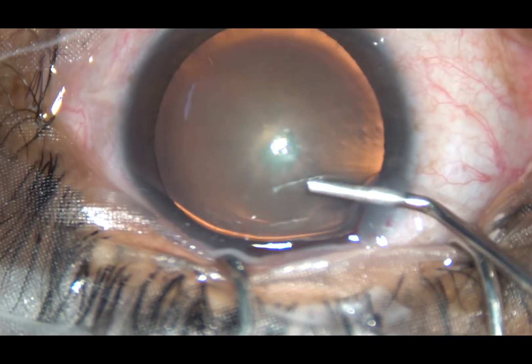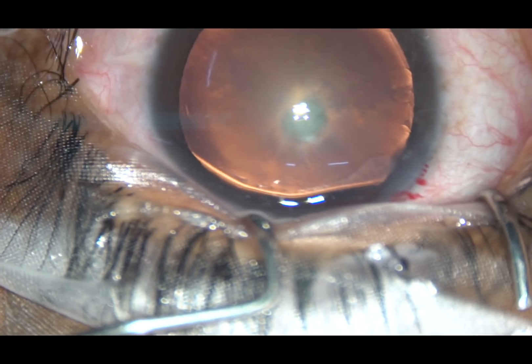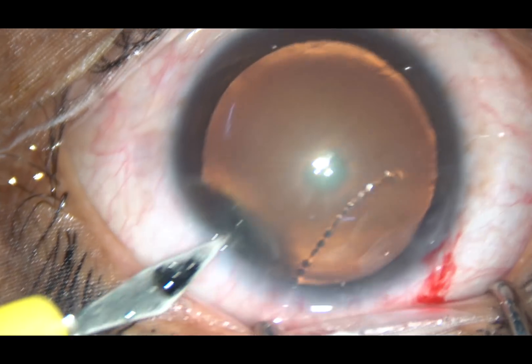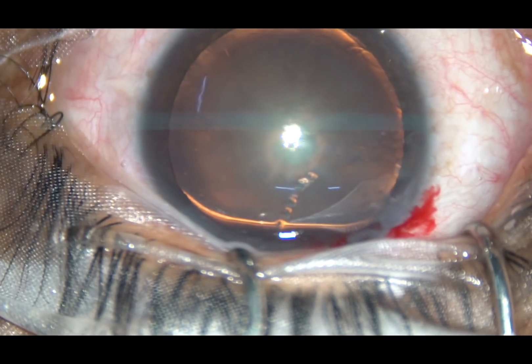Viscoelastic substance is injected into the anterior chamber. Now, one side port — only one side port is being made in this case, on the left side of the main incision, about 3 o'clock hours away.